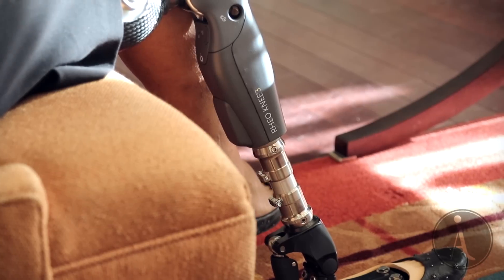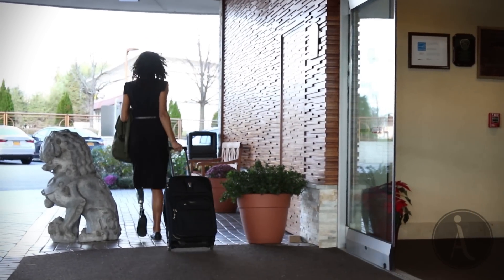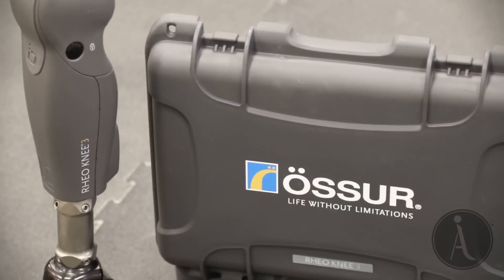Life is not always a race. The new Rione 3 Enhanced and ProFlex foot from Össur at A Step Ahead Prosthetics make it possible to relax and live your life without limitations.